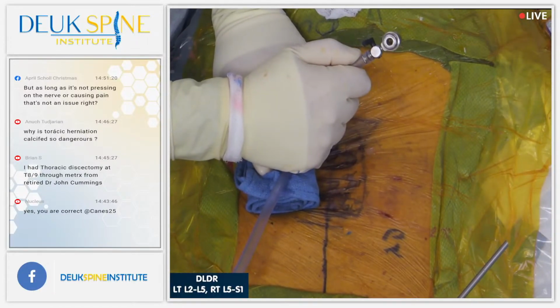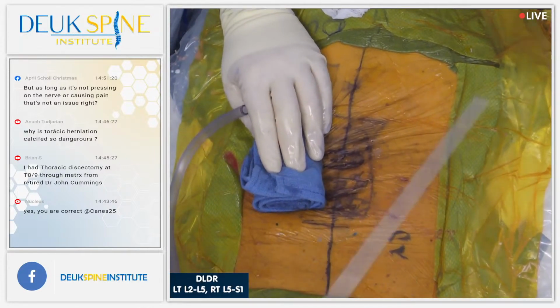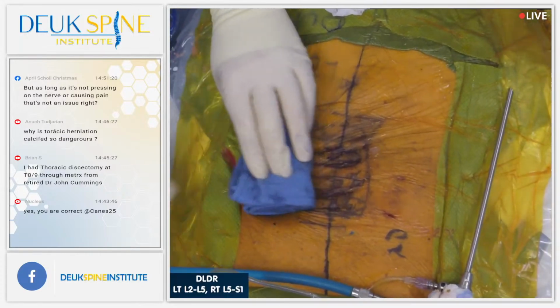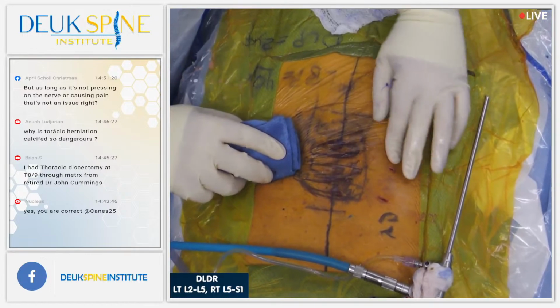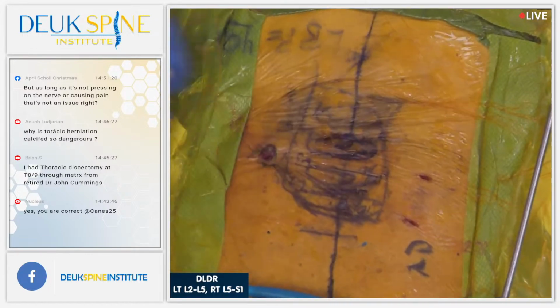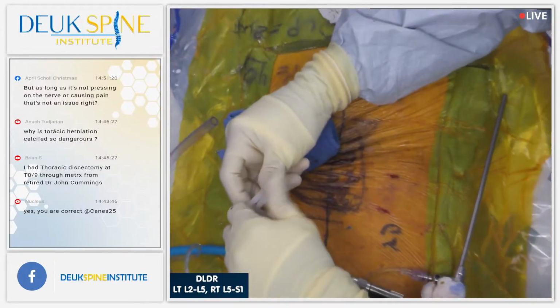Take this. For those of you who want to see what the scope looks like, that's what it looks like. And let's show the incisions. You guys see this here, Henry? Yes, we do. 2 tiny incisions there, 1 tiny incision here. Great job, everyone. Thank you for your help.